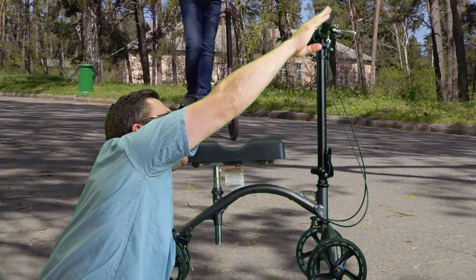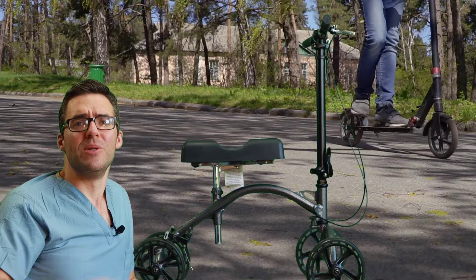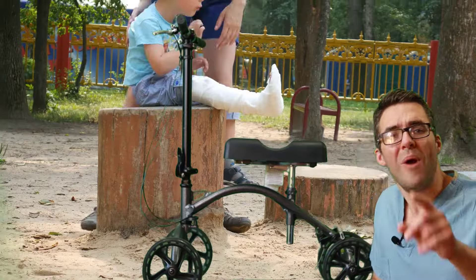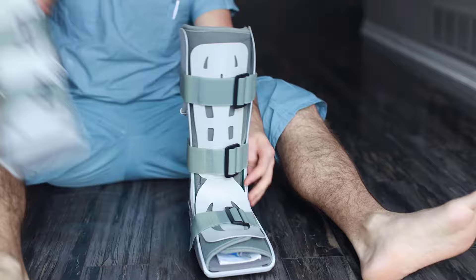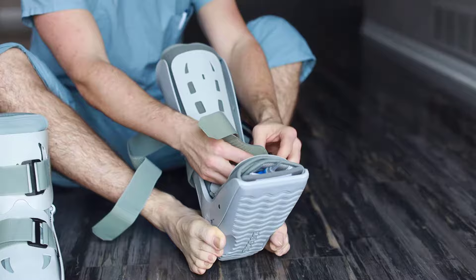This neck right here is at the proper adjustment level. Make sure the seat is at 90 degrees and your joints will feel good. When you're using your air cast or your cast, make sure you have this knee scooter to get around outside. When you have a knee scooter, make sure you get a nice boot or cast.